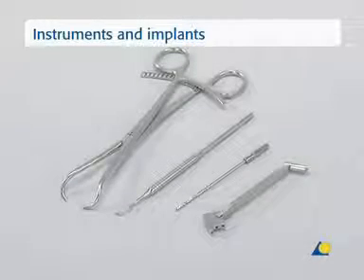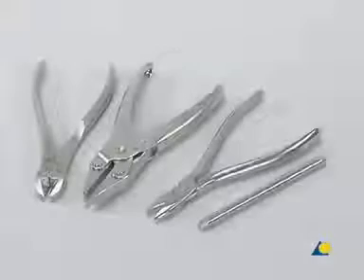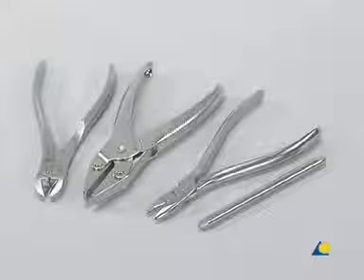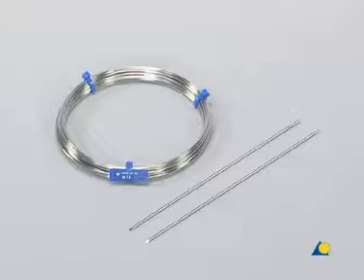The instruments used are, from left to right: the large pointed reduction forceps, the sharp hook, the 2-millimeter drill bit, and the 2.0 triple drill guide. Also needed are the small wire cutter, the flat-nosed parallel pliers, the wire bending pliers, the bending iron for K-wires, and the hammer. The implants used are a coil of 1-millimeter diameter cerclage wire and two 1.6-millimeter diameter K-wires.